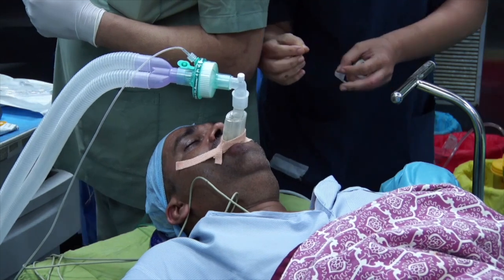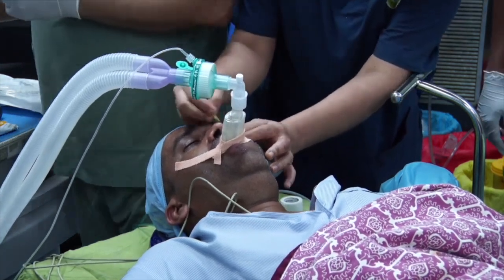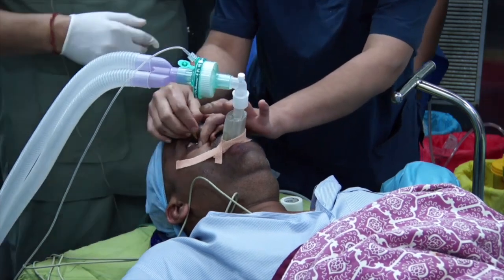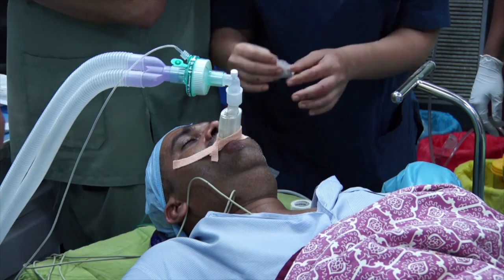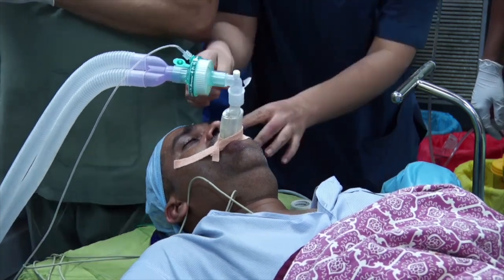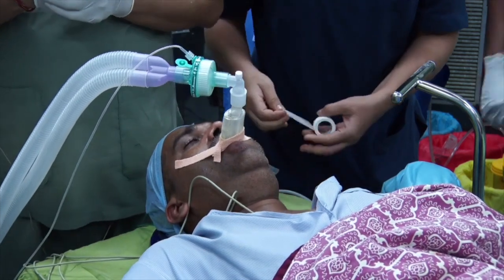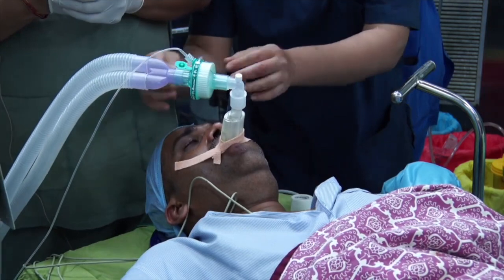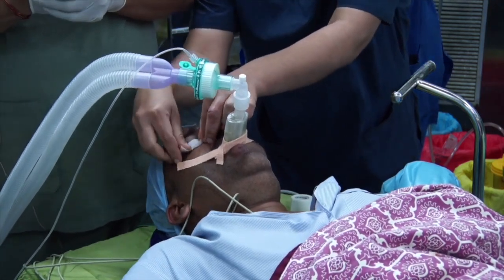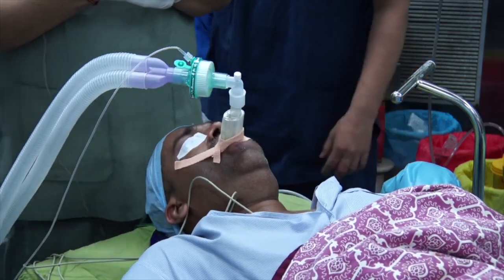MAC is one — let's leave it. What is the concentration of inhalational agent you're using? One MAC. Once you do the block, you can actually come down to around 0.7 to 0.8.